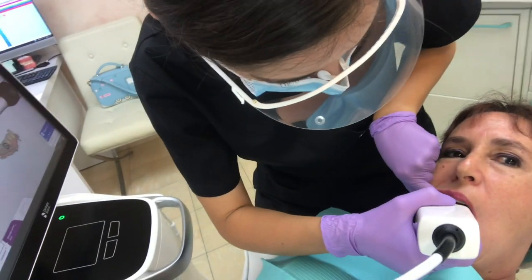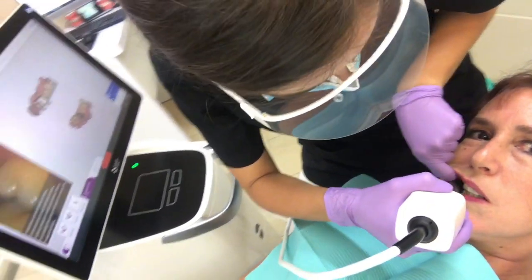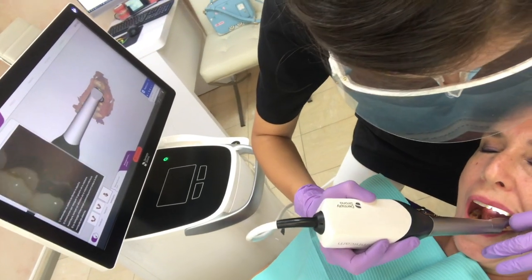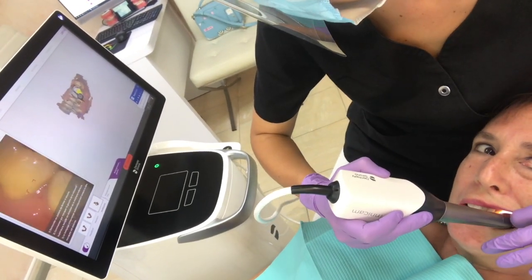Go on, up — bite for me please. Slide up, the same thing. Go on, bite for me please.